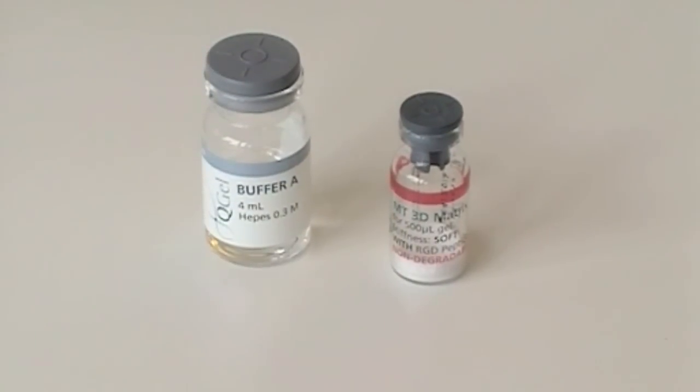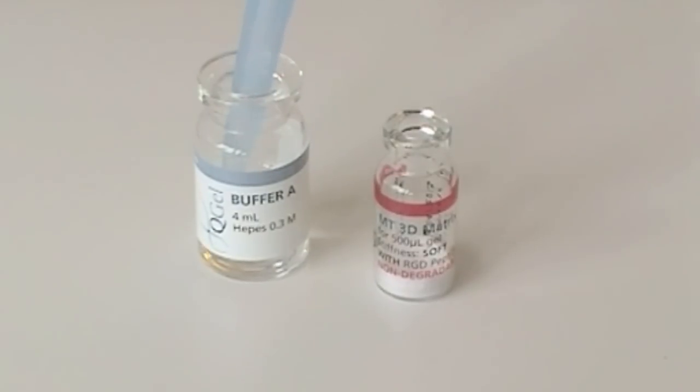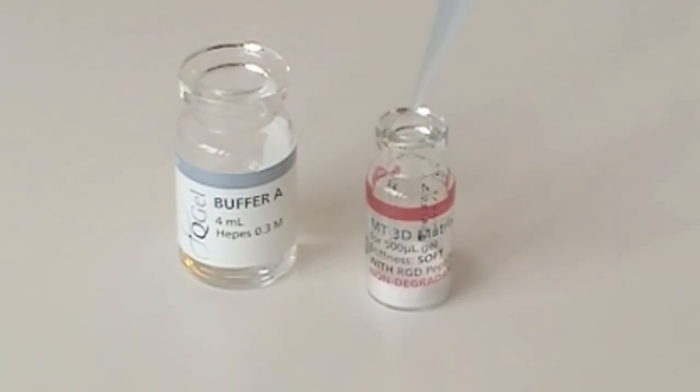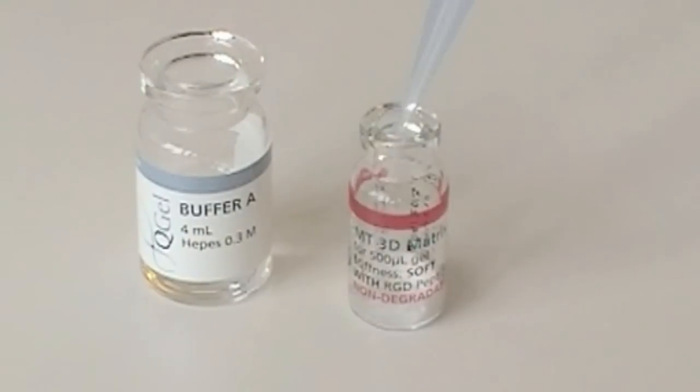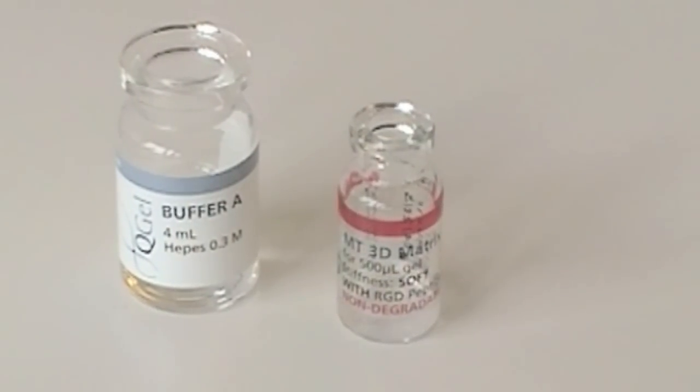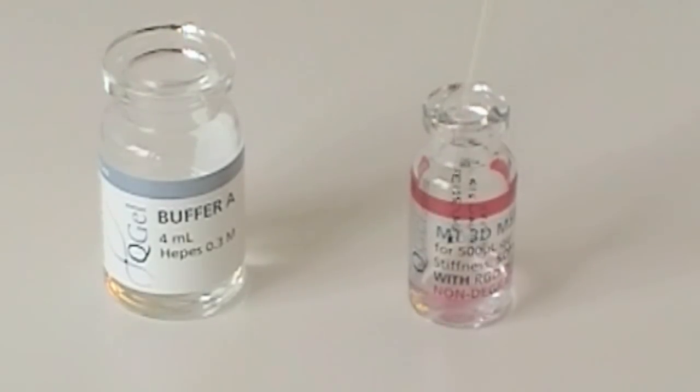Prepare the vials and cap them and pipette 400 microliters from the Q-Gel buffer and add to the vial containing Q-Gel MT 3D matrix powder. You will notice how it dissolves, but be sure to immediately vortex the vial for 10 seconds and then add 100 microliters of your cell suspension.